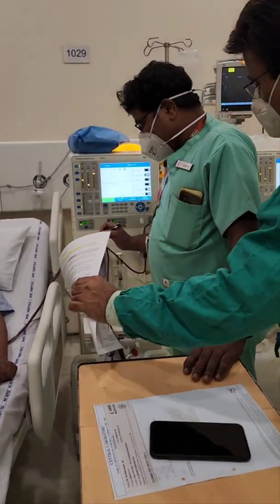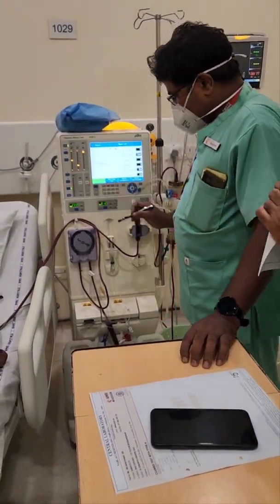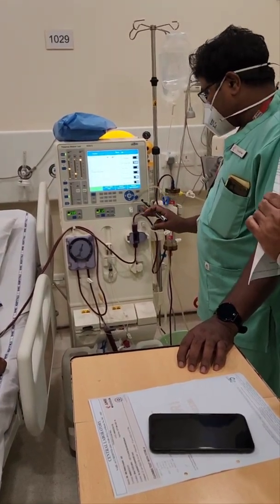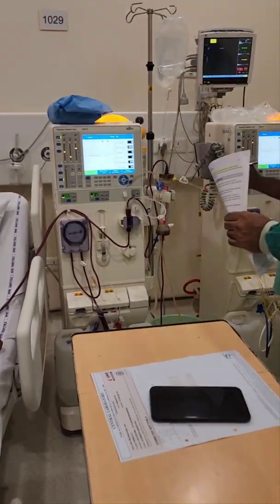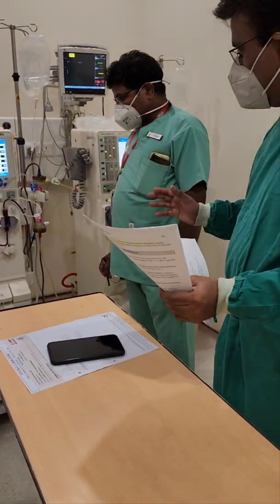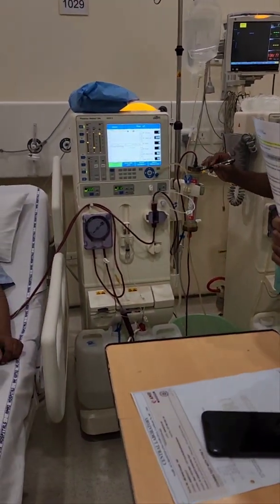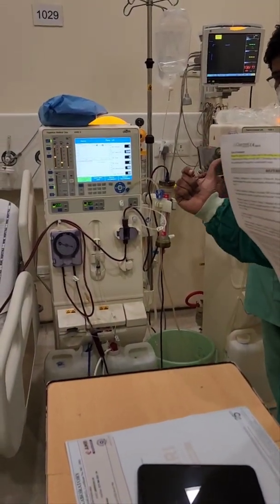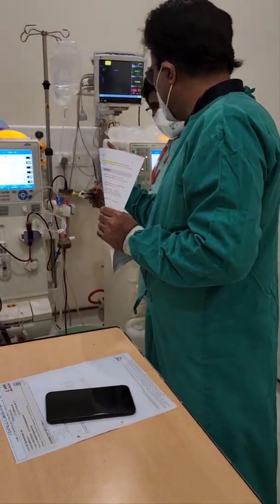The blood comes out from the patient through the arterial line. Here, as you can see, we are using two dialysis machines side by side. We don't need anything extra — just two conventional dialysis machines. The blood coming out of the patient goes to the plasma filter. Apart from the glycosorb column, the other key component we need is a plasma filter — a conventional plasma filter.